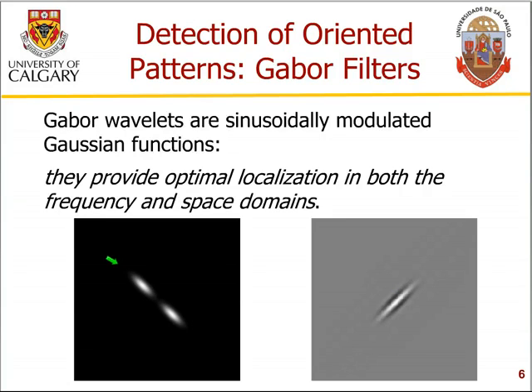The Fourier transform of this filter is shown in the image on the left-hand side, where you see that the image is a bandpass filter. The low-frequency components at the center of this figure, which is the 0,0 frequency in the Fourier domain, are rejected, and the medium frequency components are passed by the Gabor filter as indicated by the bright regions in this image.